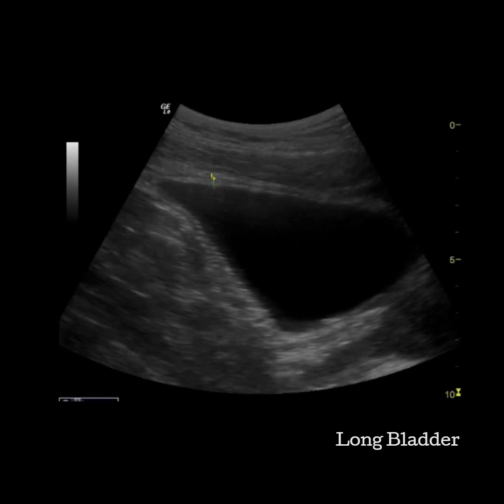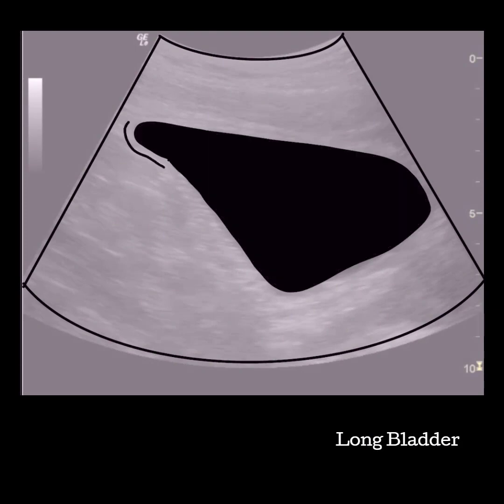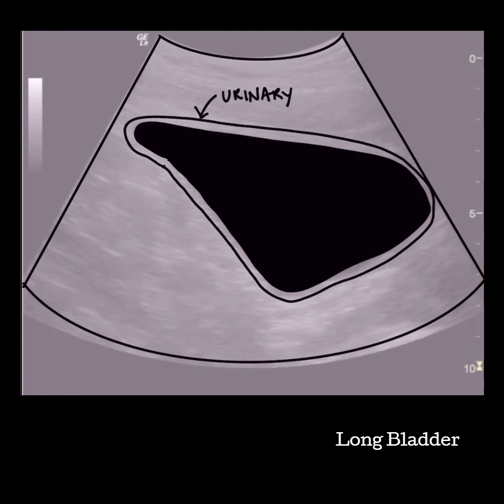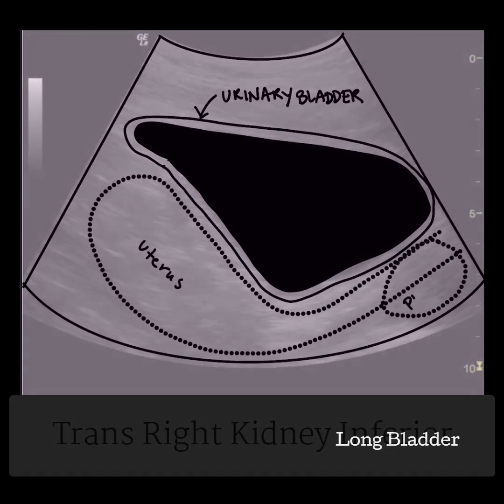The long bladder image can also be used for measuring the bladder wall. The distended bladder should be seen anterior to the uterus and prostate and superior to the pubic symphysis. Sweep beyond the bladder in both planes to evaluate for dilated ureters.